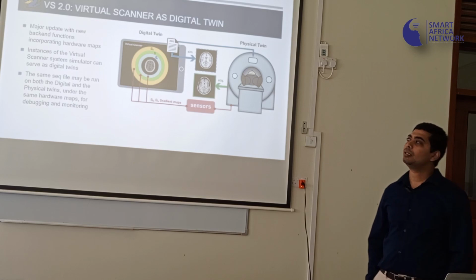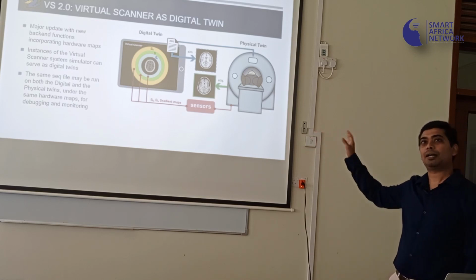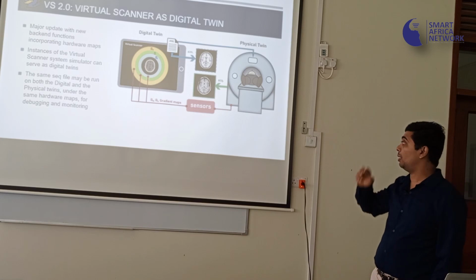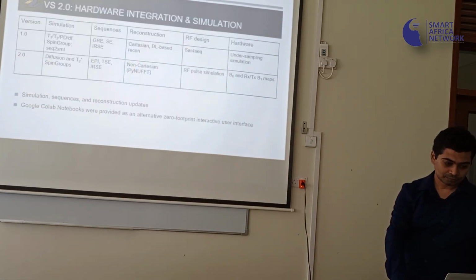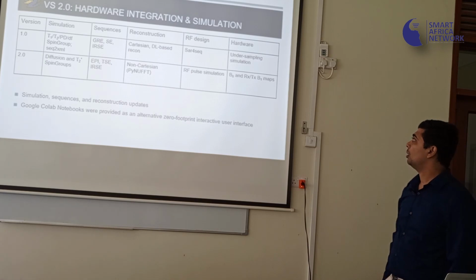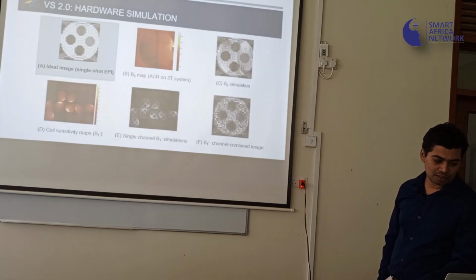That's one way. The other way is to also keep learning from the real scanner and be able to debug the real scanner by learning from what might have gone wrong with it. So we've demonstrated a case wherein we've picked up phase artifacts from the real scanner and fixed it. So we've done a bunch of simulations for different kinds of sequences and also different hardware features. So this is mostly what it can do.